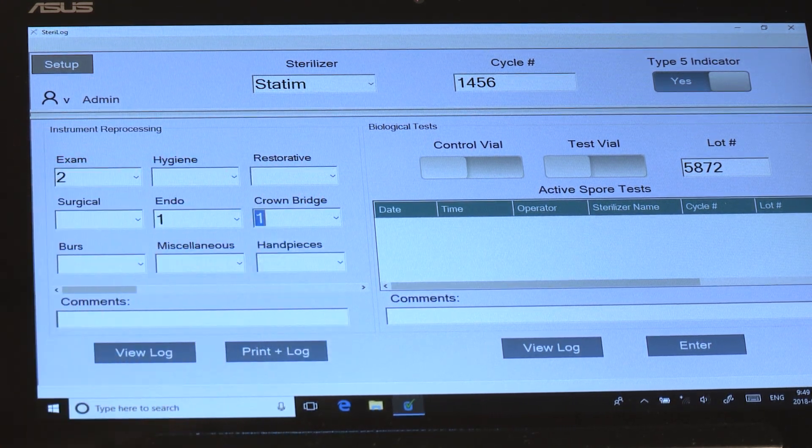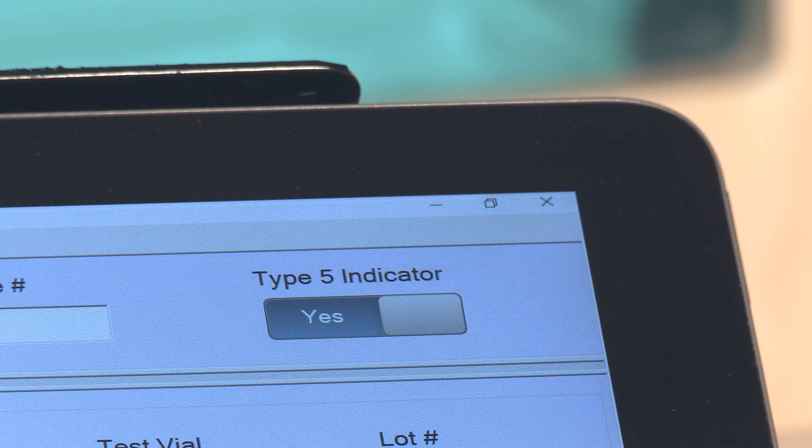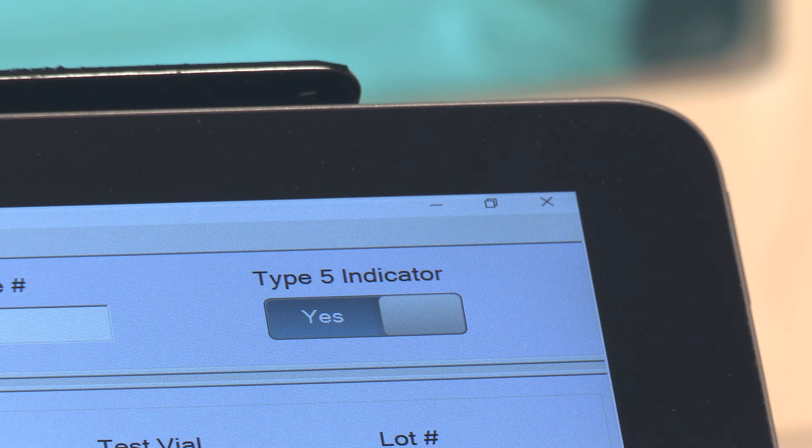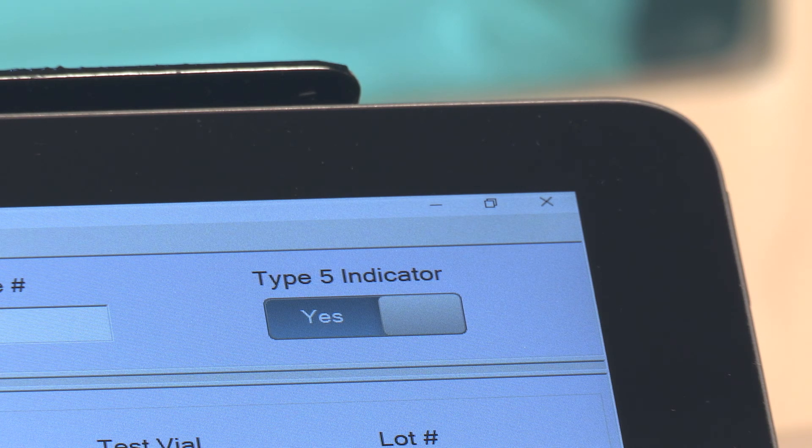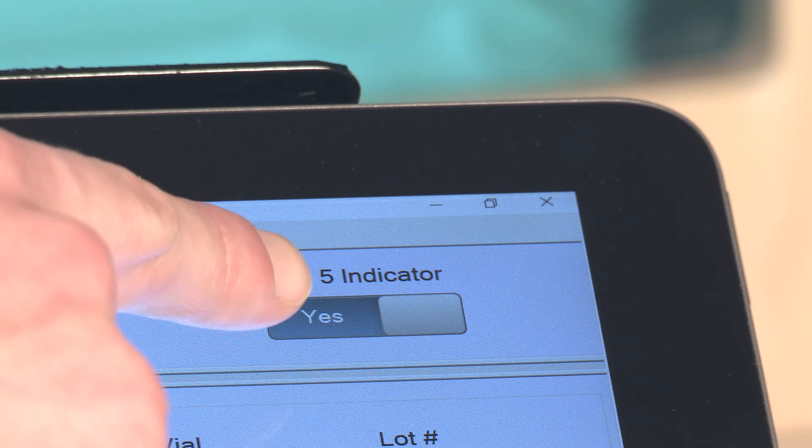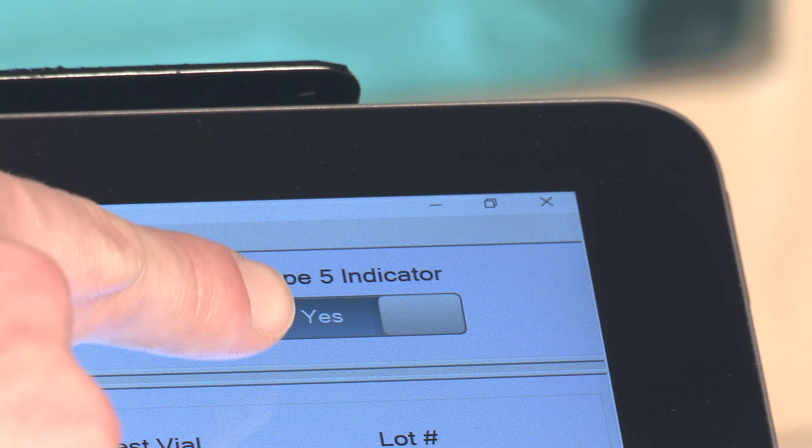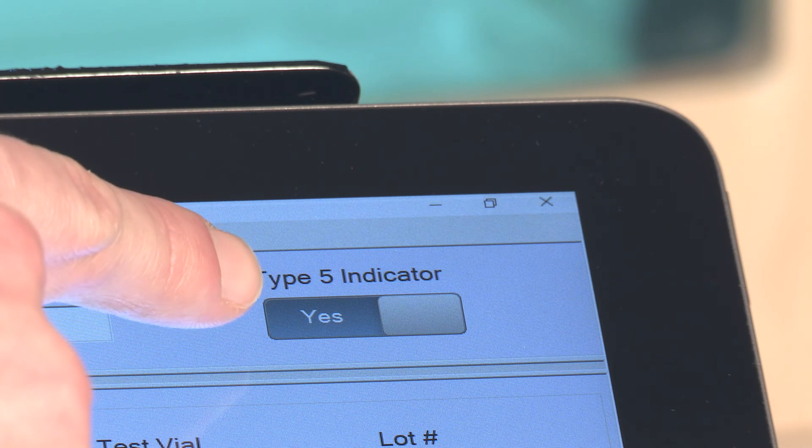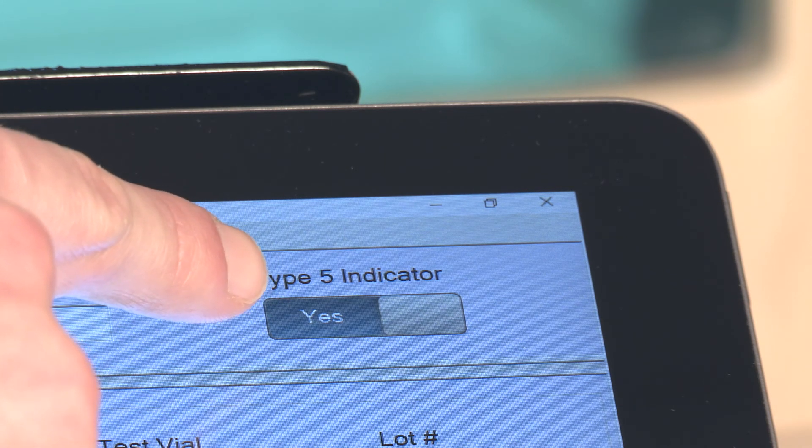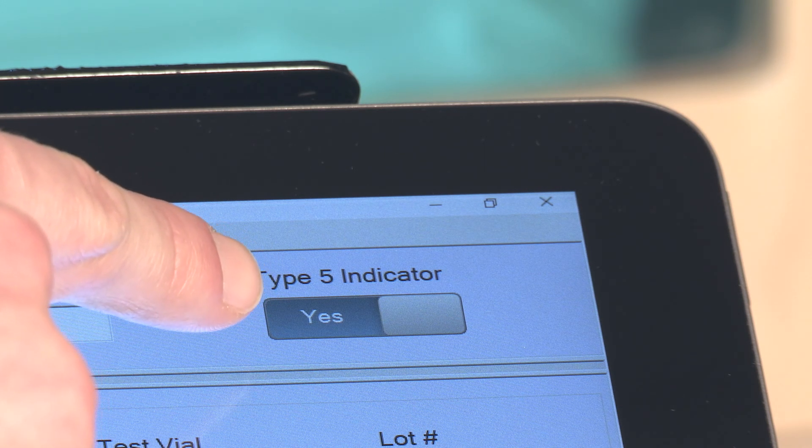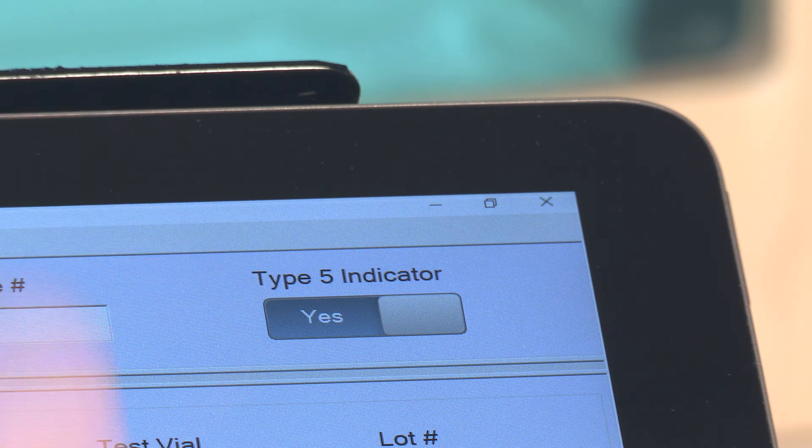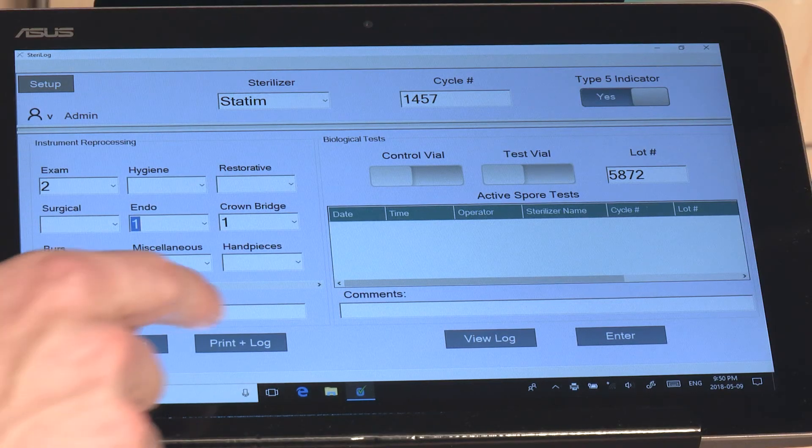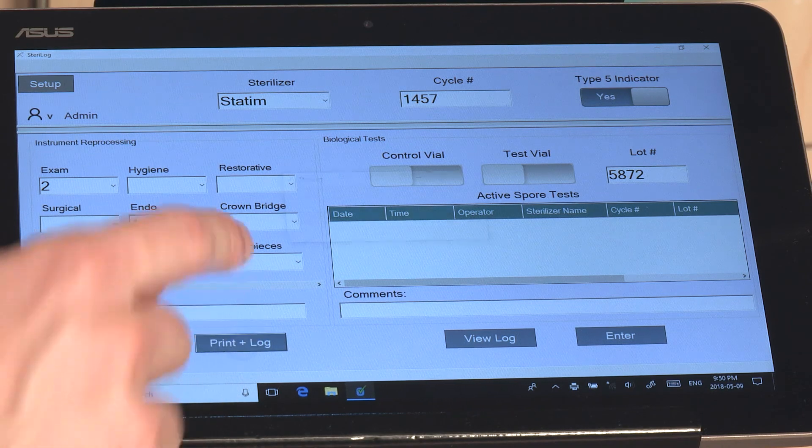You would then select your kits, so for example two exam kits, one endo, and one crown bridge. At this point I'll just note that this toggle here allows the user to indicate whether or not they're using a Type 5 in this particular load, and hit Print and Lock.